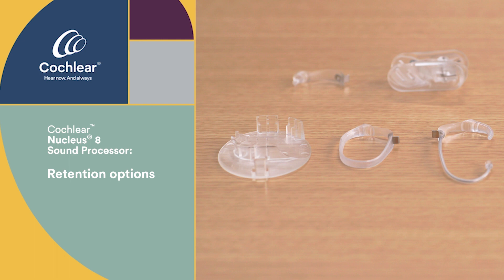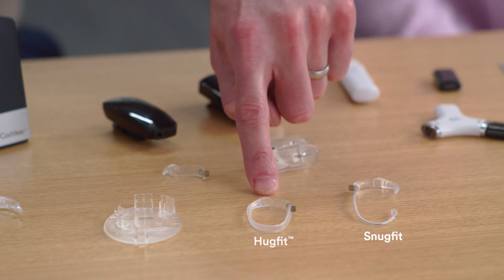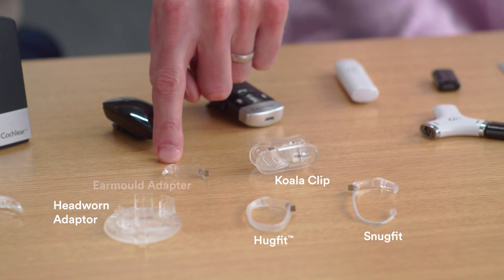Whether you're an adult or a pediatric recipient, we offer many retention options. The SnugFit earhook for added behind-the-ear retention, the HugFit earhook for 360-degree behind-the-ear retention, the head-worn adapter, which converts the Nucleus 8 to an off-the-ear wearing option, a Koala clip for clipping to your shirt, as well as an earmold adapter.